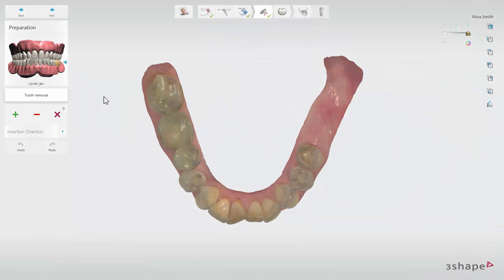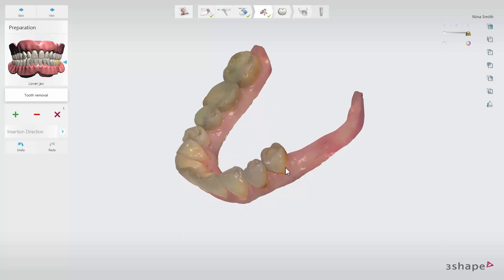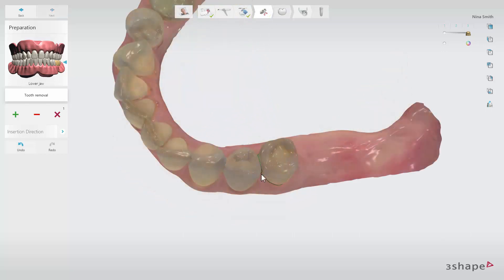From here, you can virtually remove teeth from the scan. Click on the green plus to add a patch and define the outline of the tooth which should be removed from the scan. If needed, click on the green plus again to define a new outline for another tooth you wish to remove.